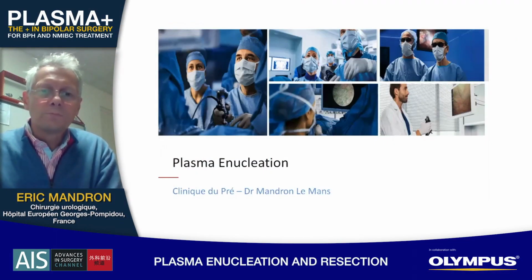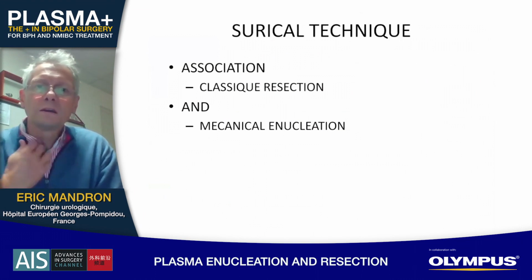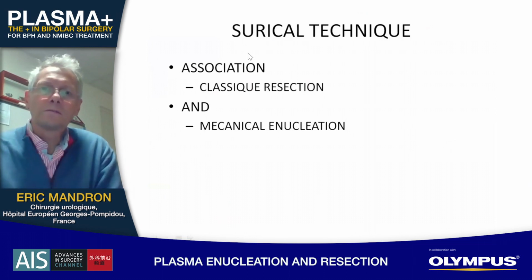The topic is to talk about plasma enucleation for prostatic hypertrophy. We talk about the surgical technique. This technique is an association of classic resection and mechanical enucleation.